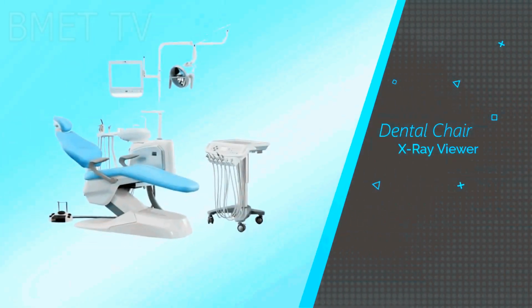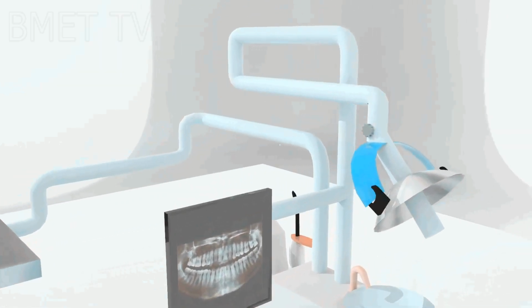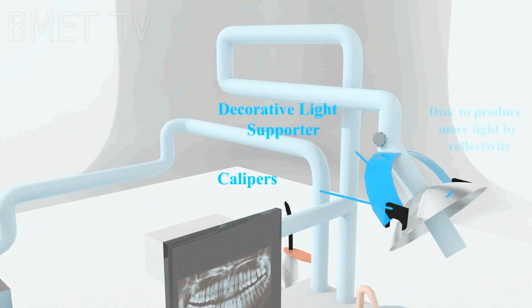The sixth component is an X-ray viewer. X-ray viewers help examine and interpret the radiographs of a patient's oral cavity or tooth. They can help determine if there are areas of tooth decay or infection, which appear darker on the radiograph as they don't absorb much of the X-ray.